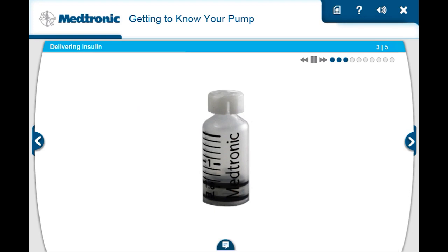First, let's look at the reservoir. The reservoir holds the insulin you'll use for the next two to three days, and it fits inside the reservoir compartment of the pump.